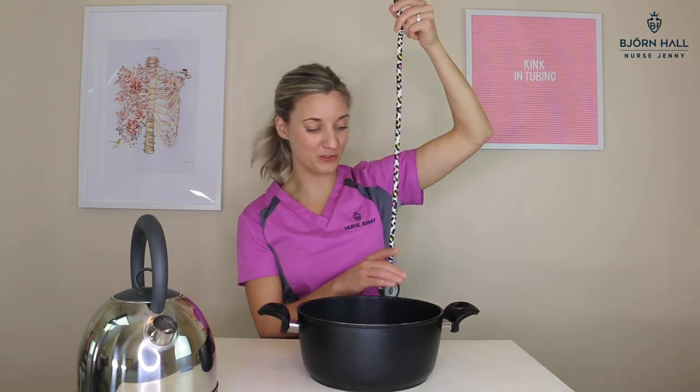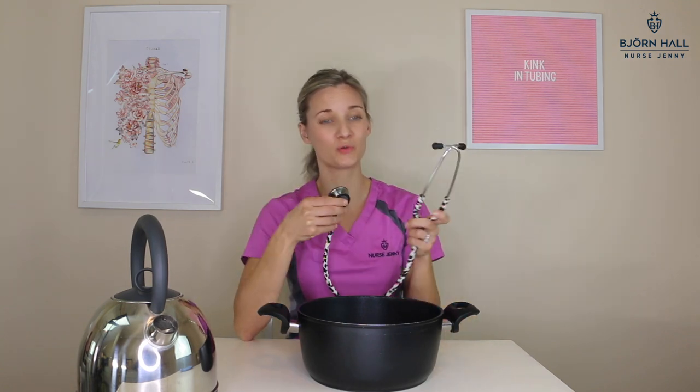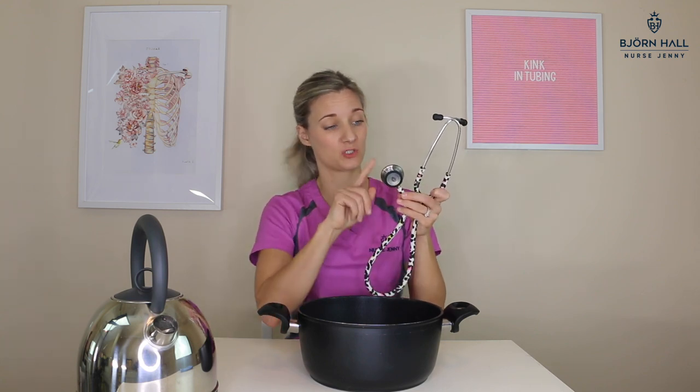Please be careful when you're doing this because you don't want to burn yourself on the hot water. And just again, do make sure you don't get any water inside the tubing. So do not submerge your chest piece, binaurals, or ear pieces into the water.